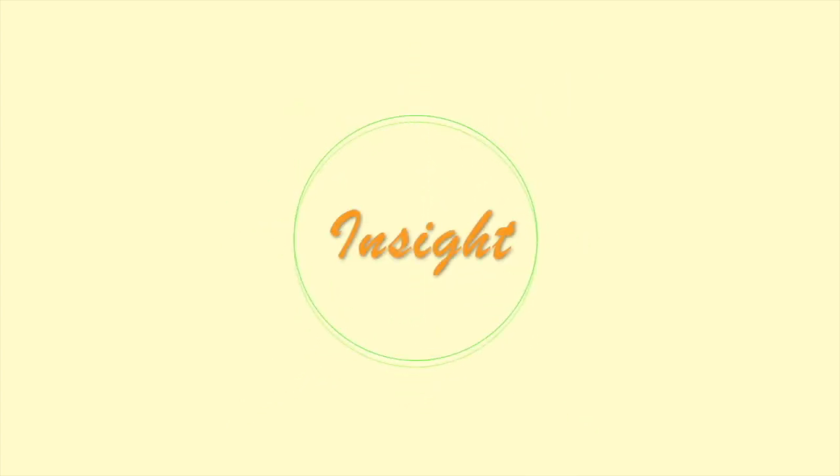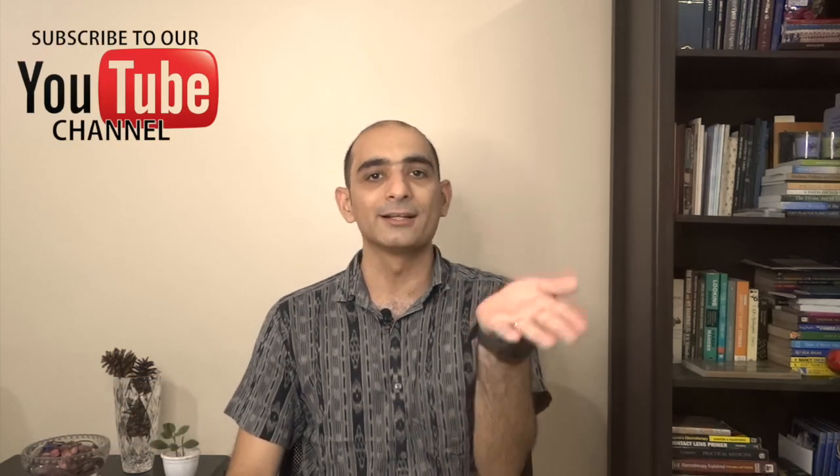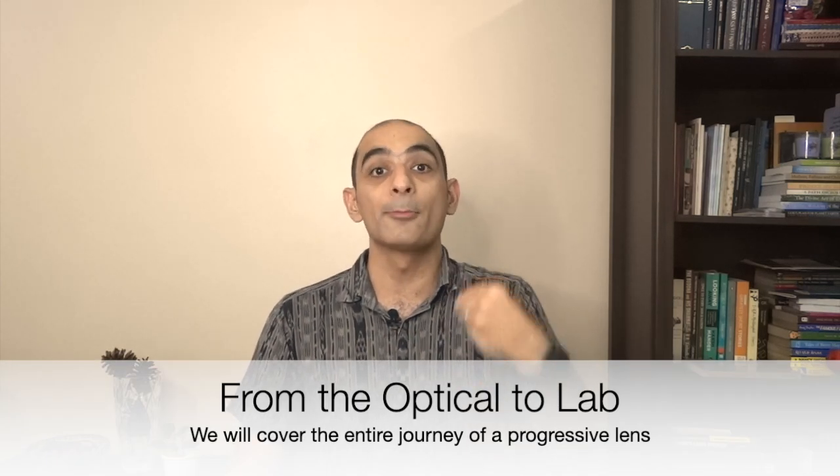In this video, we will see how digital progressive lenses are made. You must have often heard the term digital progressives or free-form progressive lenses. We have covered the difference between digital progressives and conventional progressives in previous videos. In this video, we will see how digital progressive lenses are made.